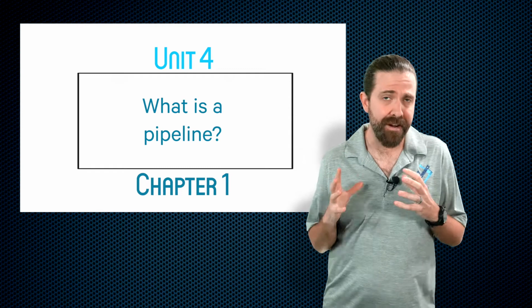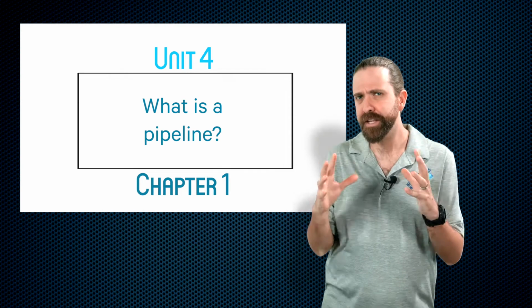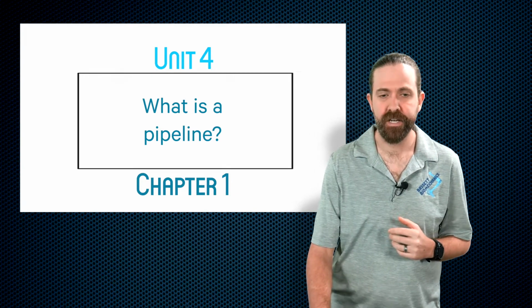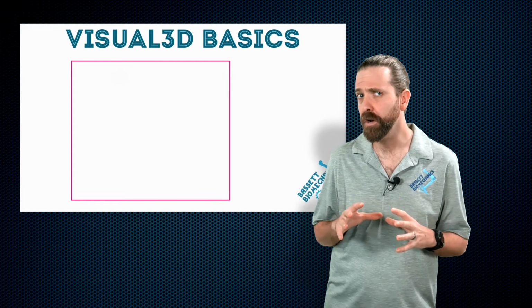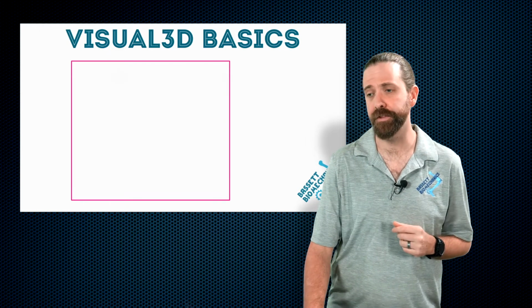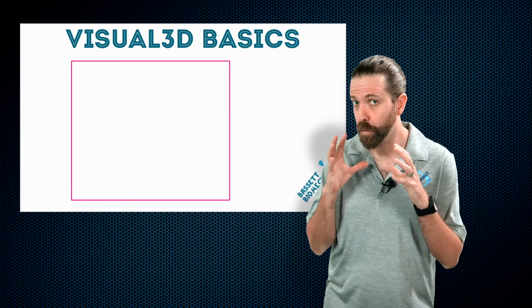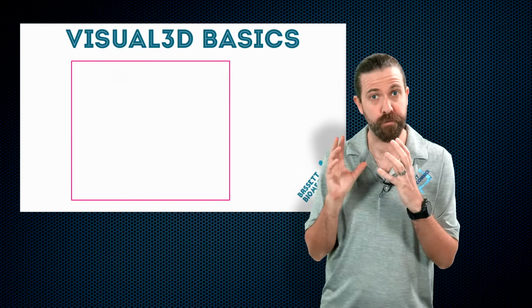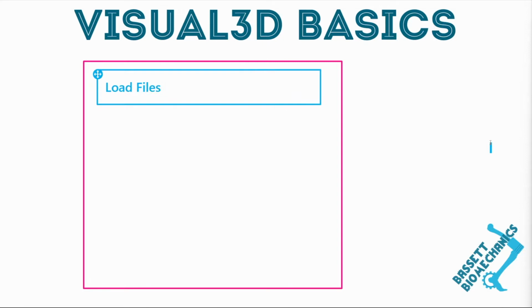If you think through everything we have done in the previous units and put it in sort of a box. So let's say this is our box. And we know within here, we are going to accomplish several things. For example, our first thing, and we are breaking it down like this for a reason, is we're going to put in another box. This will be a series of commands that is going to allow us to load our files.